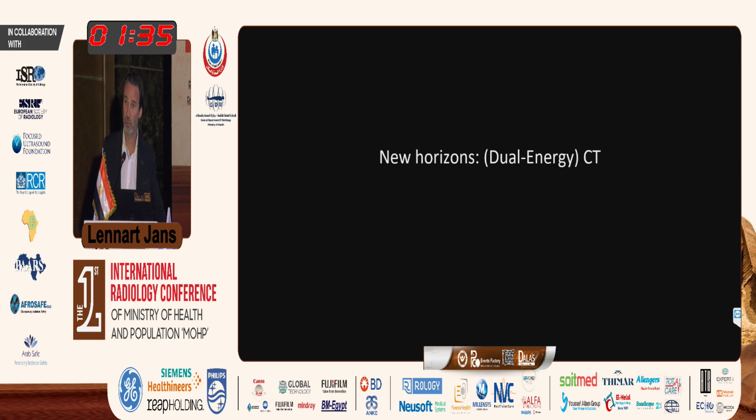Okay, so now very short, a few exciting new techniques that are coming our way. And the first one is dual energy CT. Yesterday I gave a workshop here to a few of you, and there I was surprised that some participants didn't know about dual energy CT. So most CT units these days have it. So you can go back on Monday to your departments and do dual energy CT. It will be available on every CT unit from the last few years.